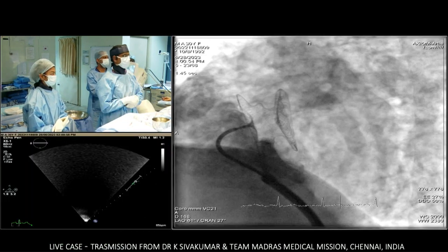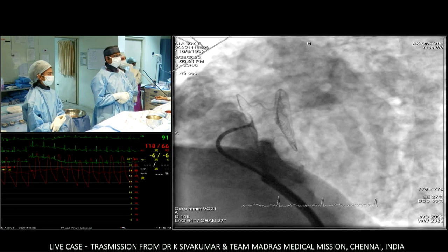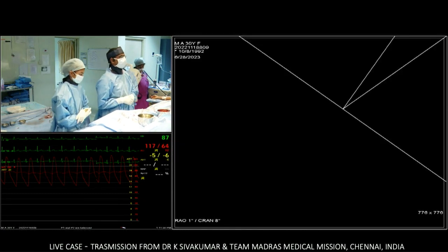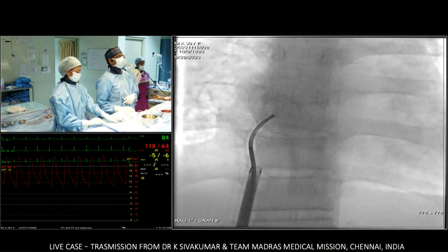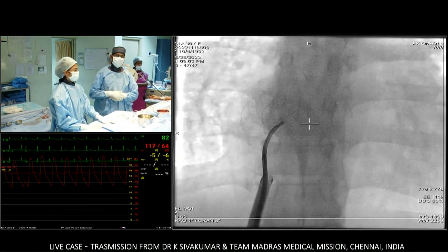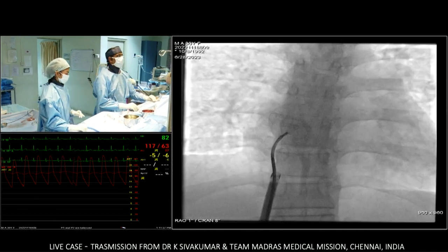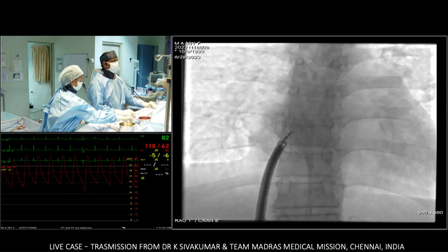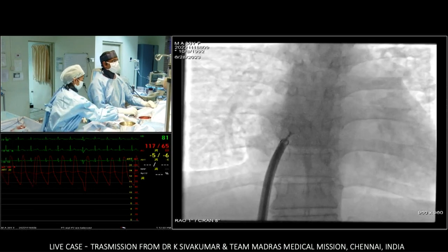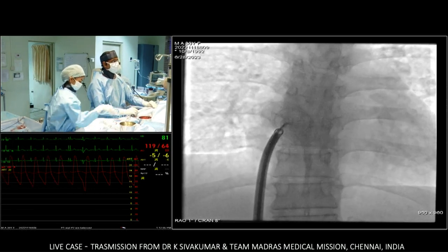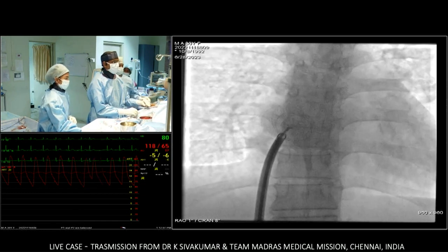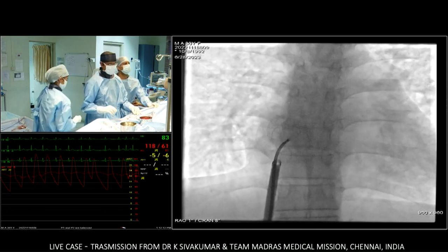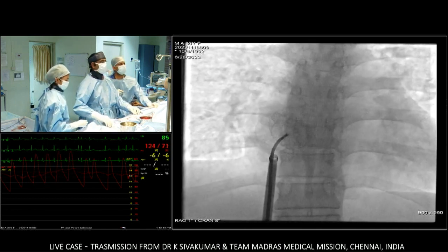Before releasing, the standard ASD wiggle maneuver is suggested — pushing on the sheath against the right atrial disc to eliminate the concavity. However, being a Travisio cable, there is limited ability to maneuver the cable in the usual way, as the Travisio does not allow it.